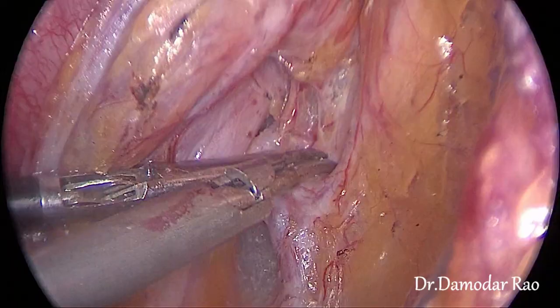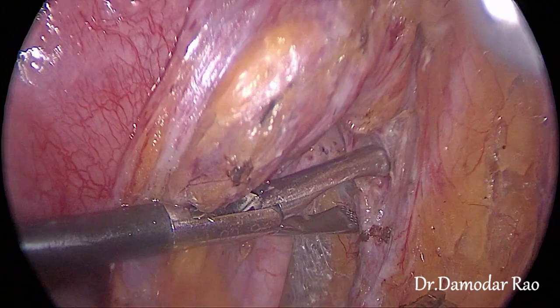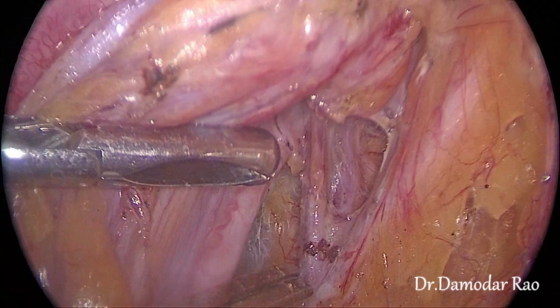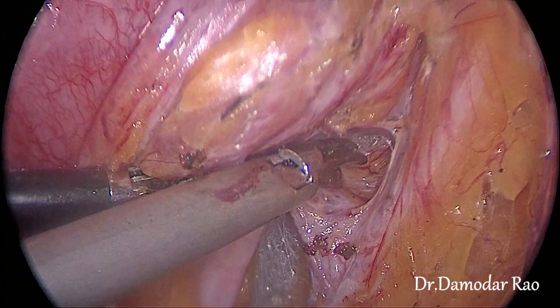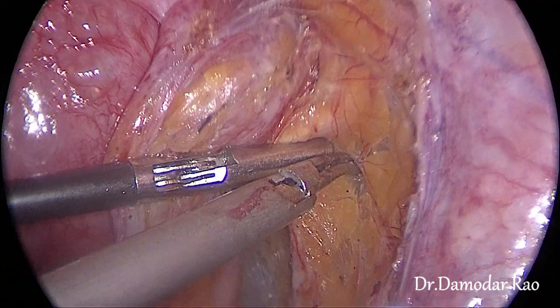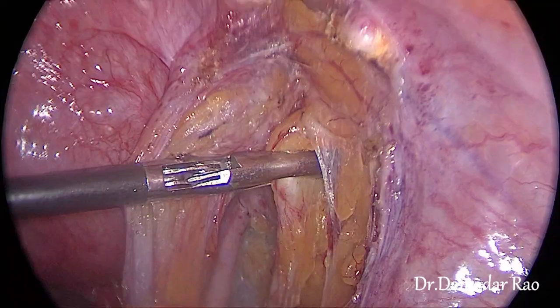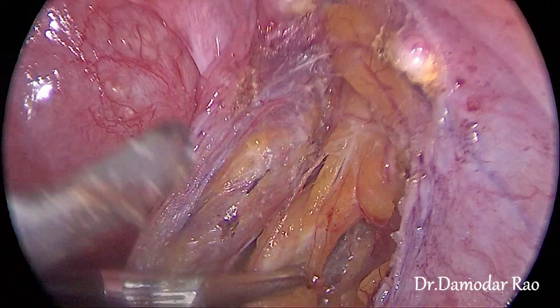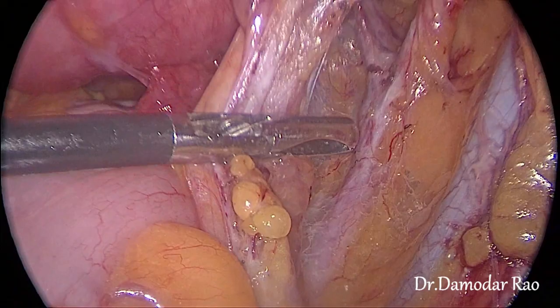Here I am holding the uterine artery and pushing the fibers parallel to it so that it becomes exposed. You can see the uterine artery clearly originating from the internal iliac artery. The structure that is lateral to the uterine artery is the obliterated umbilical artery, which is the other branch of the internal iliac artery. I am holding the obliterated umbilical artery here and skeletonizing it. If you tug on the obliterated umbilical you should see its impression on the anterior peritoneum, which confirms the obliterated umbilical.